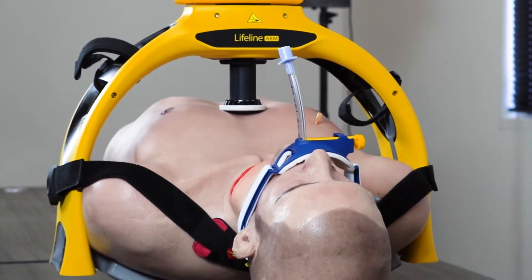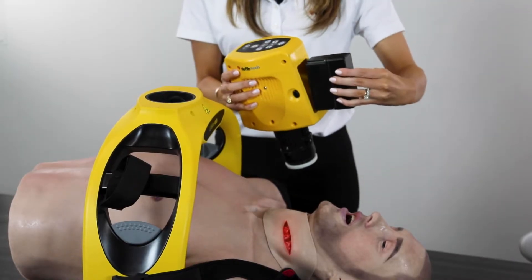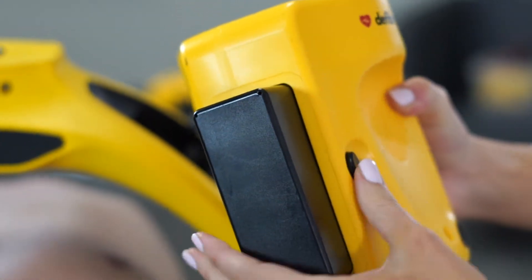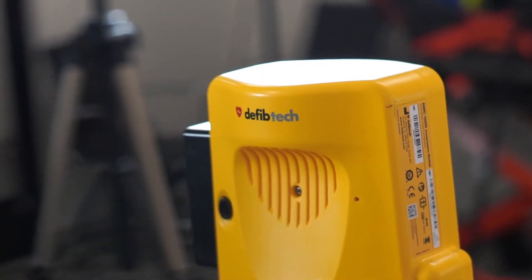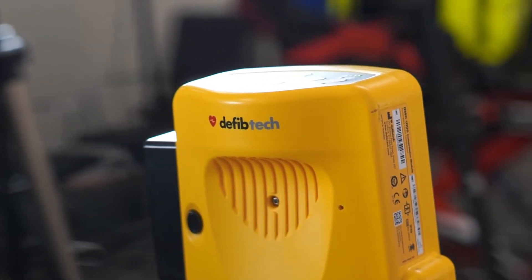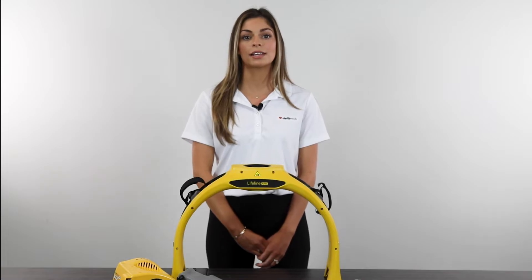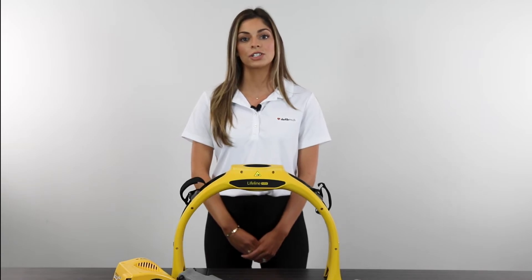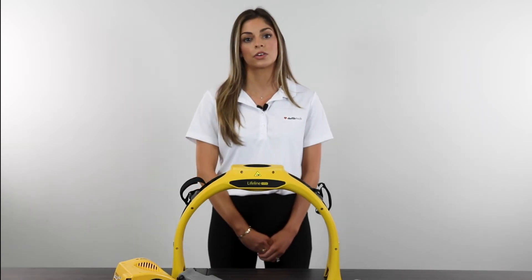The DeFibTech Arm comes with advanced battery technology. The hot-swappable battery can be inserted in multiple orientations, and the AC power adapter recharges the battery even while in use. The intuitive battery pack design carries a long life and run time, using less battery power to compress while providing the same amount of strain every time. Each battery pack lasts around three years or 300 charge-discharge cycles. DeFibTech offers a battery charging station that can fully charge a pack in two hours, or two packs in three.